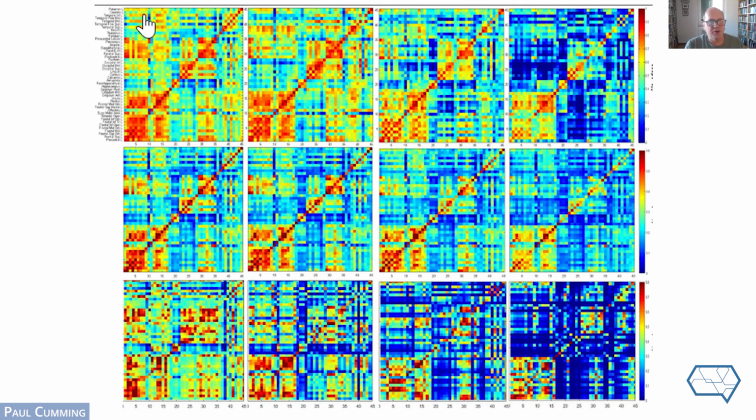And you see that there are zones where there's a high correlation, indicated by red. Never mind what regions they are, the text is far too small to read, but a normal brain shows clusters of brain regions that are interacting with each other and are sort of covariant, so that they have naturally high activity together in parallel, and other regions shown in blue where there's lesser correlation.